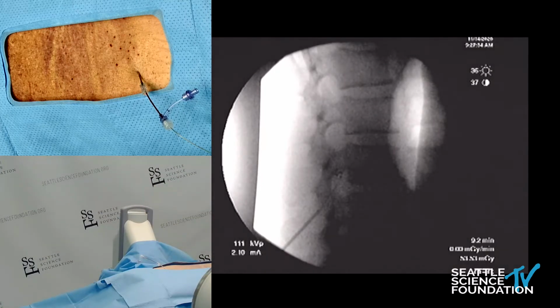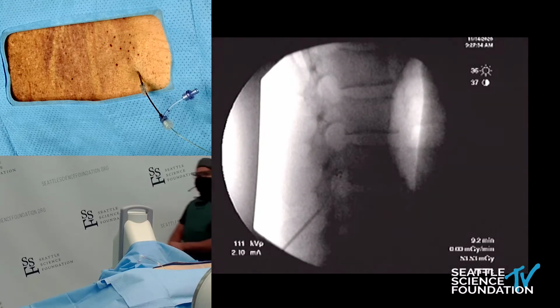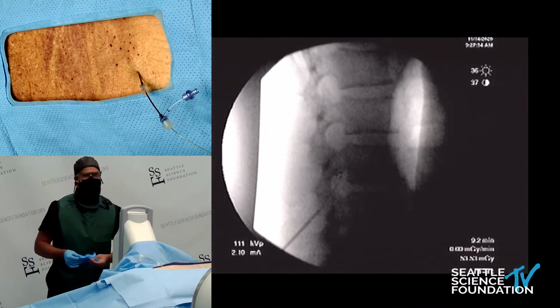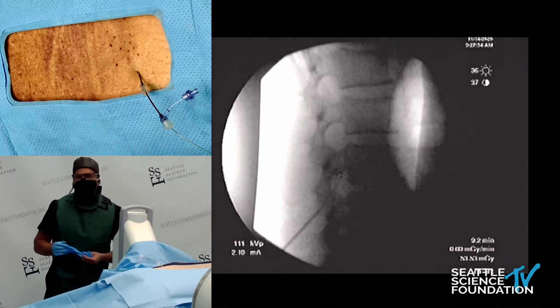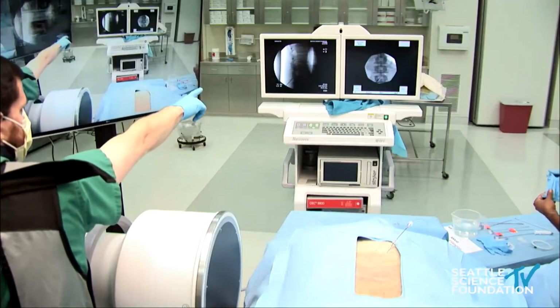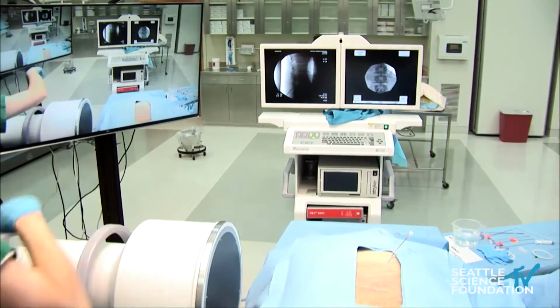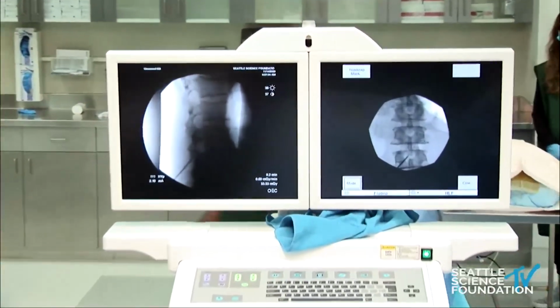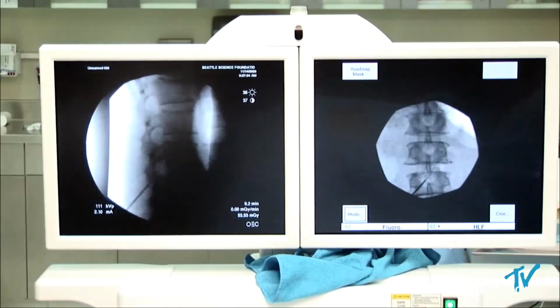So we got a great view of that foramen. And what we're looking for here are where the contacts are located. Is there a screen, one of these screens I can stand next to point out some things? Yeah, viewpoint restricted. Okay, perfect. I'm gonna walk around here and I'll just point out the image here, which is really important.